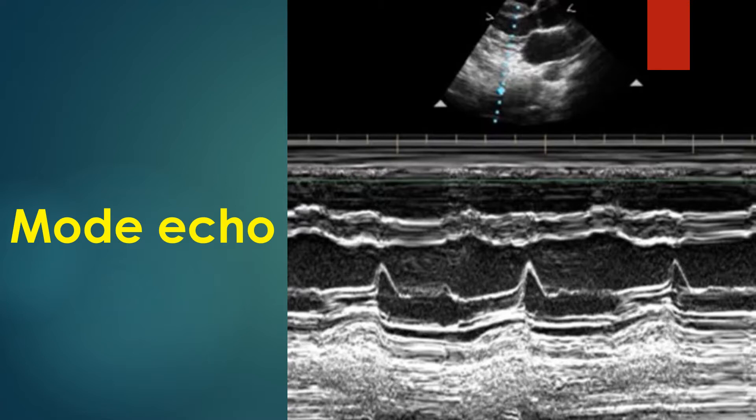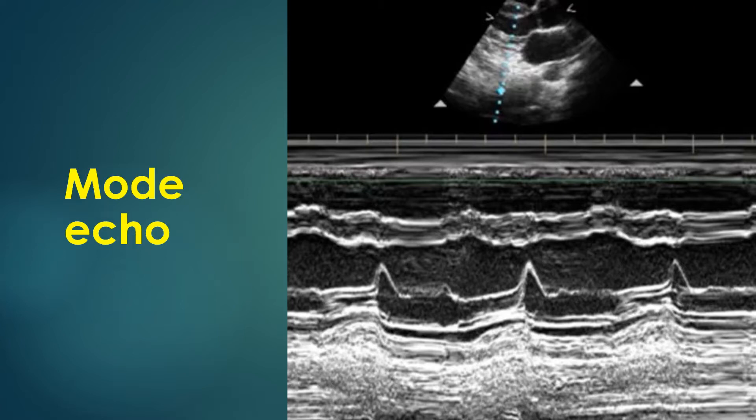The left ventricular posterior wall moves anteriorly towards the left ventricular cavity in systole. The systolic and diastolic measurements are taken using computerized calipers and the software calculates the dimensions and ejection fractions. The interface between two different media produces the best echoes, as demonstrated in the pattern of the interventricular septum — both upper and lower margins are echodense while the intervening tissue is less echodense.